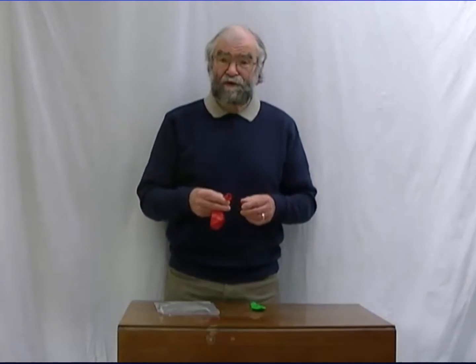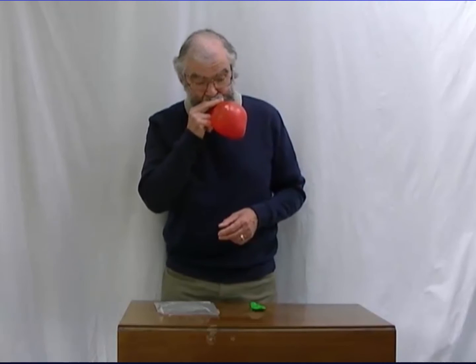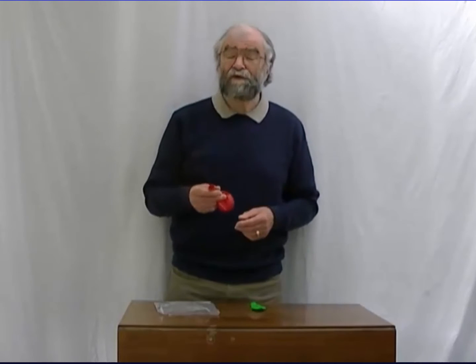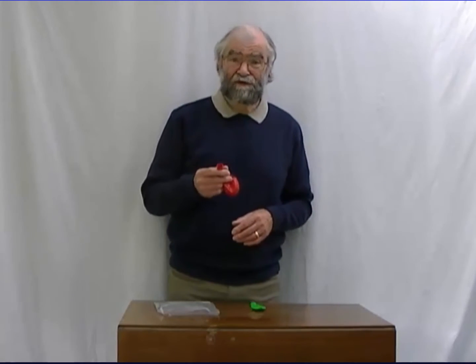So if I blow at a normal flow rate, you see we get a larger volume, and I had to blow harder. The pressure went up because of the resistance to flow. That's why the volume went up as well. So this is already a slightly higher pressure system.